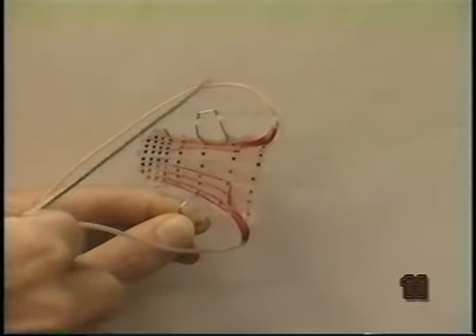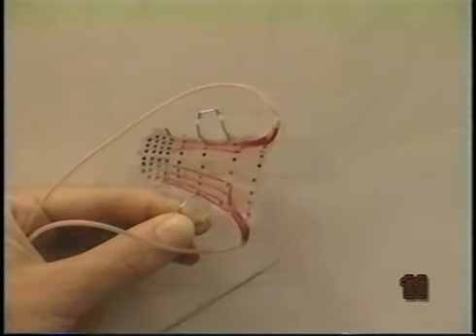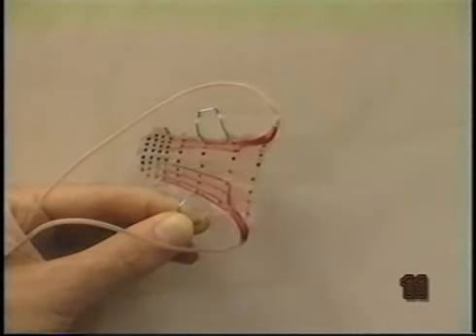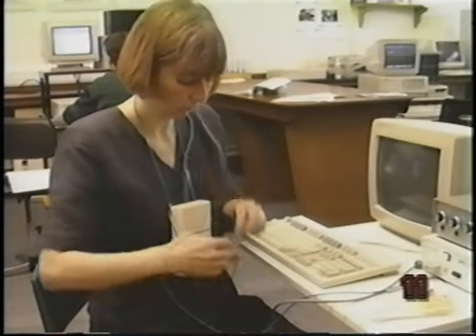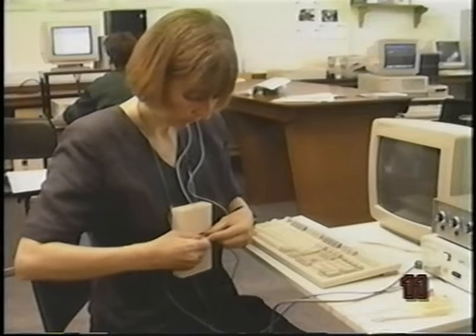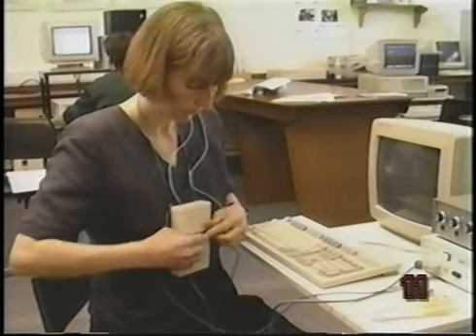Wires from each electrode are fed into 2 cables which pass out of the subject's mouth at the corners, usually behind the wisdom teeth, so as to interfere as little as possible with normal speech. Once the subject has the palate in place, she plugs into a multiplexer unit worn around her neck and connects to the computer interface.